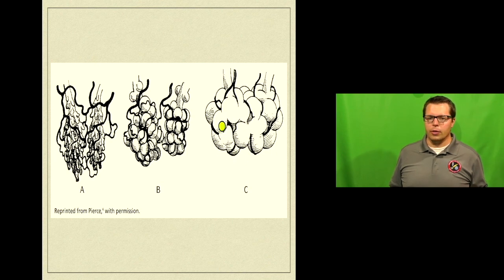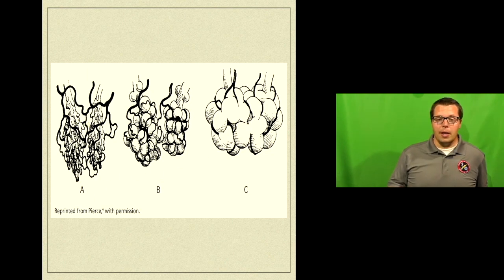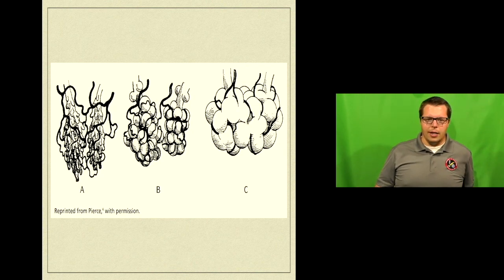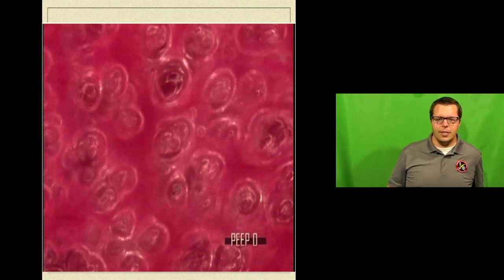So they get overfilled and sometimes even damaged. So what we want to do is make everybody look like the guys in the center and minimize the amount of extra pressure that we have to put into these guys, which injures them, and we want to increase the number of these guys that are open to participate in gas exchange to get more alveoli in contact with blood and oxygen. So positive end expiratory pressure does that.